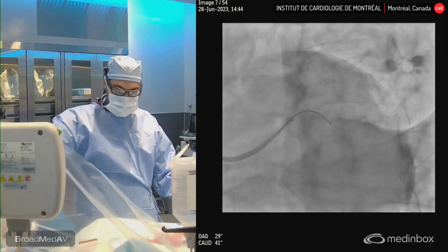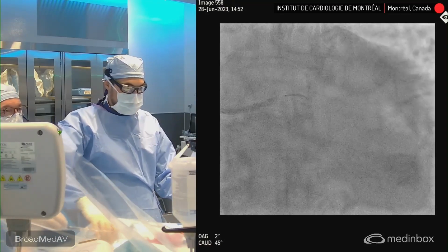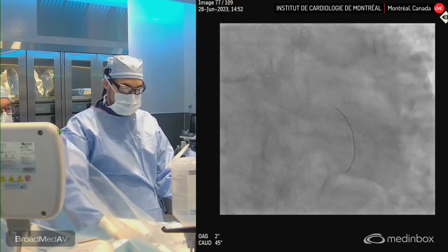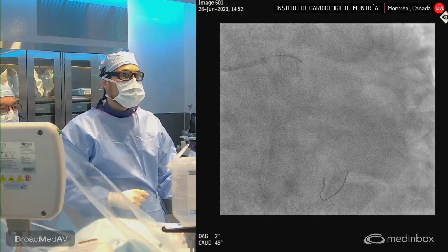So next slide, actually show the wiring with the microcatheter. Next. Yeah, next. That's good. So this is a supercross angle microcatheter, 90 degrees. Show the previous. Show with the microcatheter, please. Yeah, before the UP4. Wait, this one.